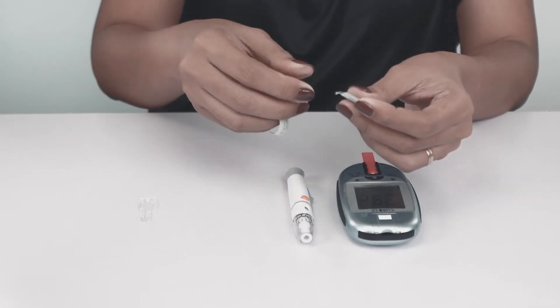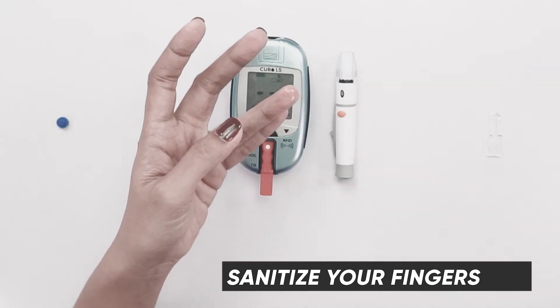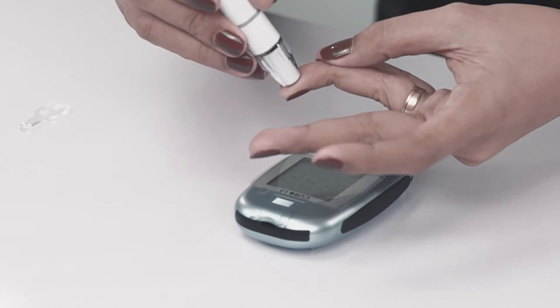Sanitize your finger to make sure it's clean, then gently massage your finger. To prick your finger, press the middle button. Then gently squeeze your finger to get a good drop of blood.